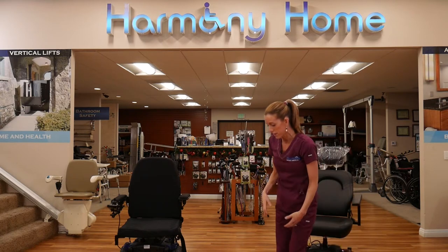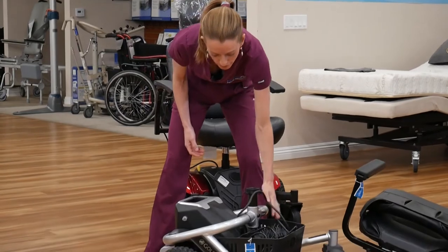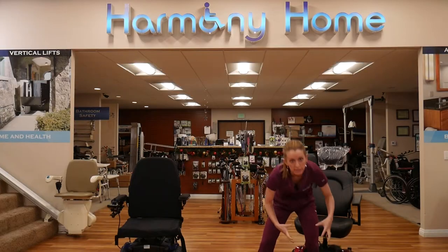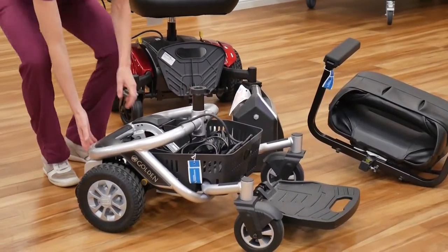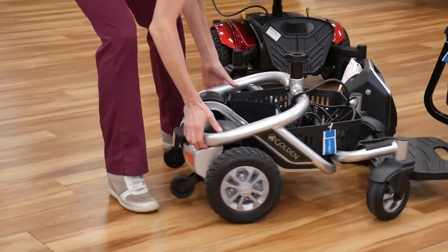The heaviest pieces on these power chairs are the motors, and they're 35 pounds. Then comes the battery — it's a nice compact dense box but pretty easy to lift. Then we come down to the frame and the motors, and I'll spin it around to show you.